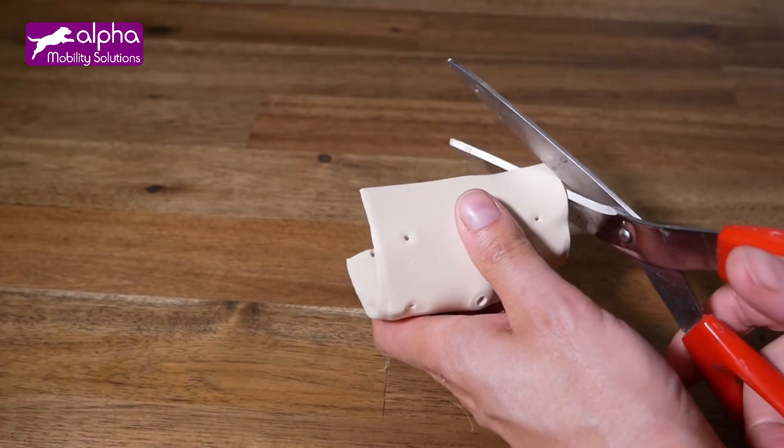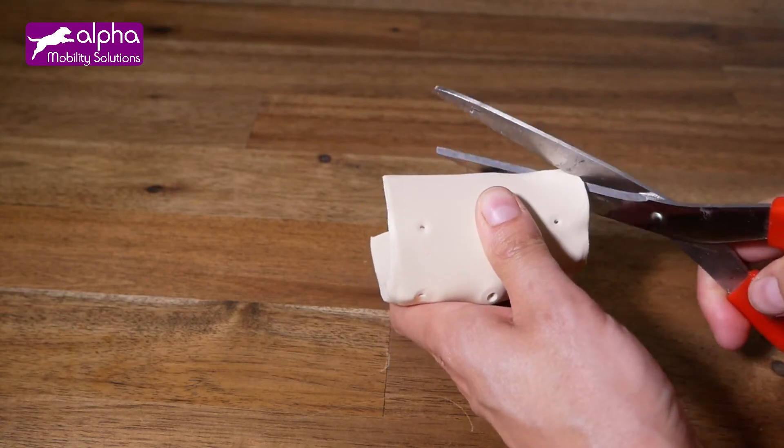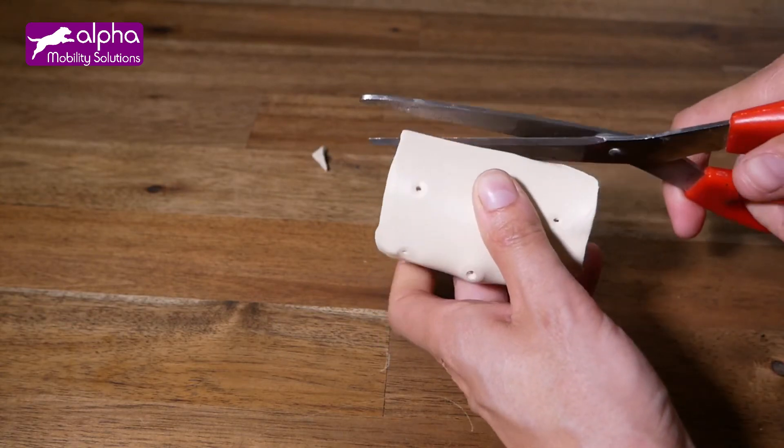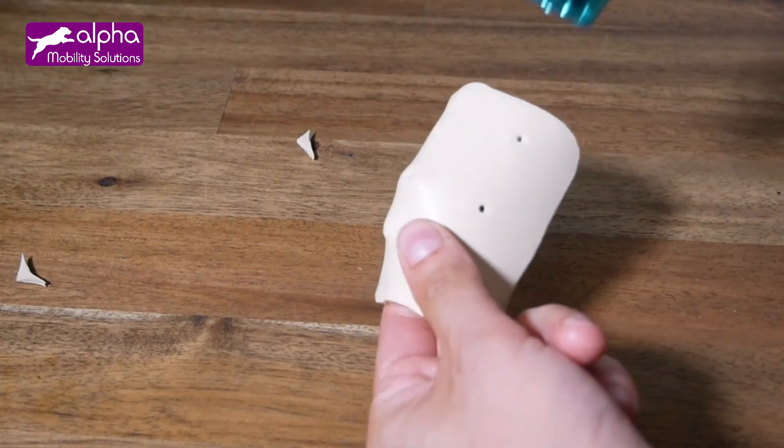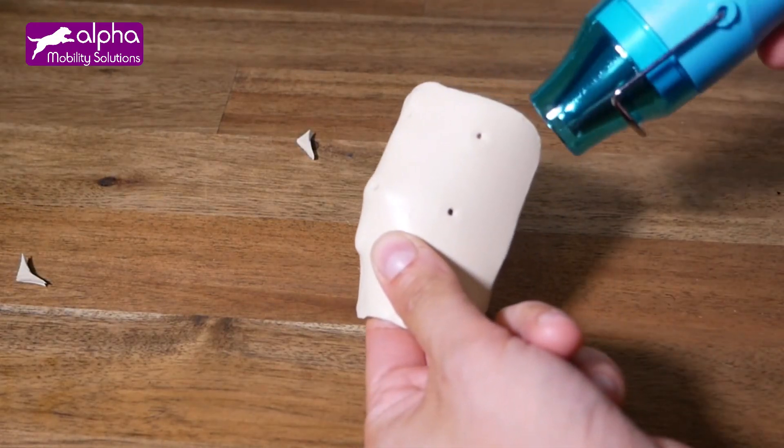You can take the time to smooth the corners and the edges. Use scissors to cut the corners, then a heat gun or hot water to soften the edges and rub them until they become smooth.